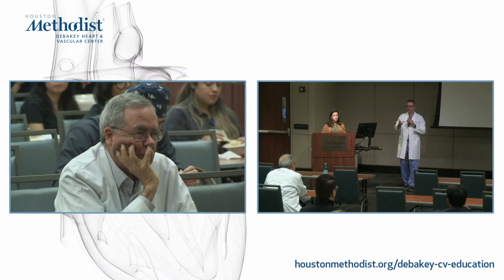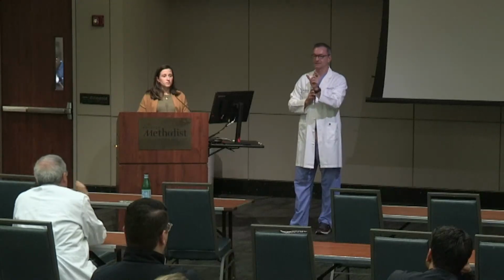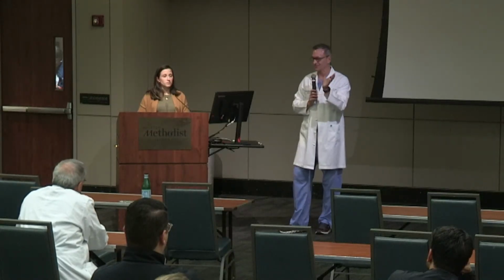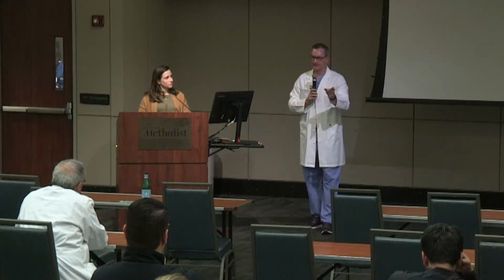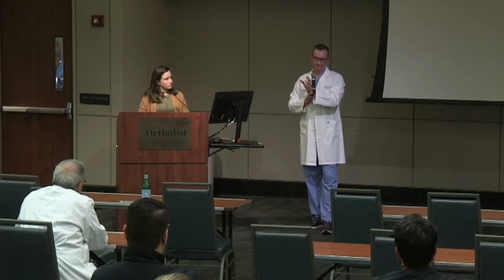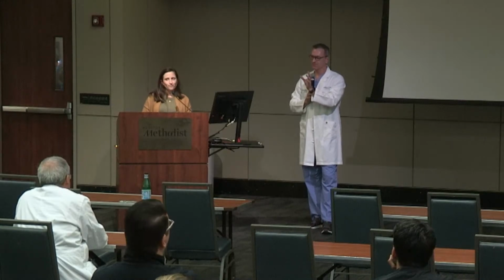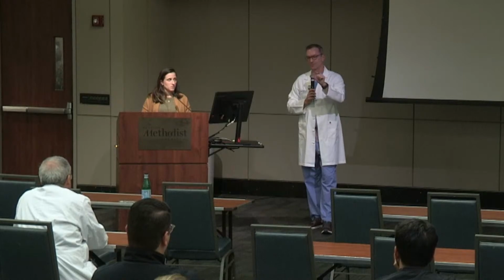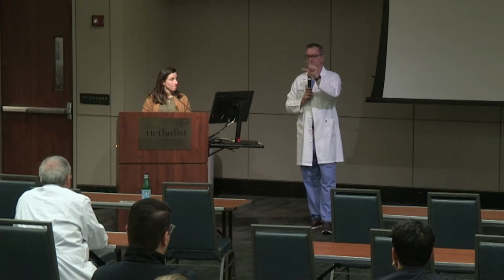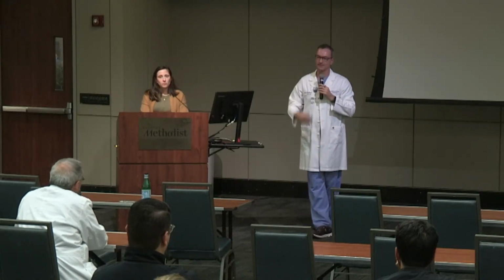So what's happening clinically, to your question, is we are going after bigger ones now. The gap, if 7 is ideal, 7 or less, 7.2, I don't know where the 0.2 comes from, but 7 is what we think about. Less than 7 is a green case, you want that. More than 7 is challenging. More than 10 or 11 is probably hard to do, but 7 to 11 is doable, but you do it differently. You do zip and clip. You start in the commissure and work your way, pinching so that by the time you get to the 11, it's now 7 because you've pinched a little bit on the way. These are the sorts of things you can do now that we have newer clips and better catheters.